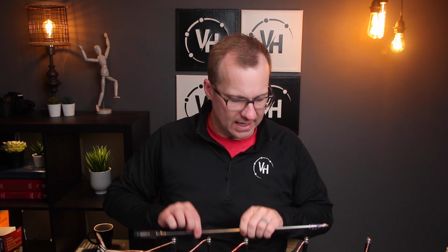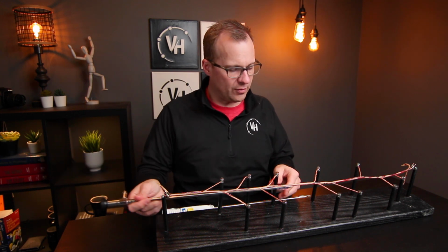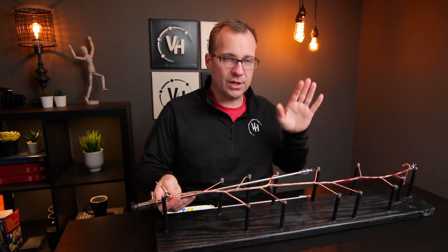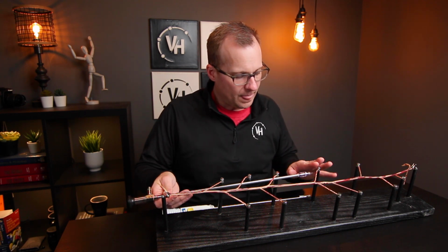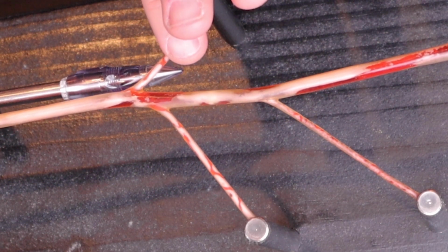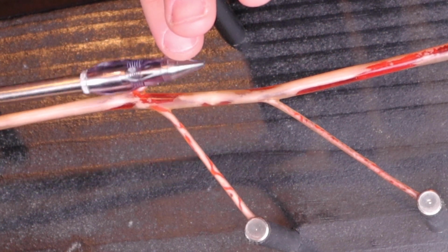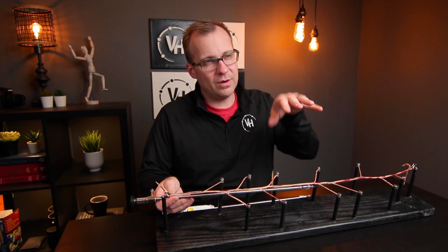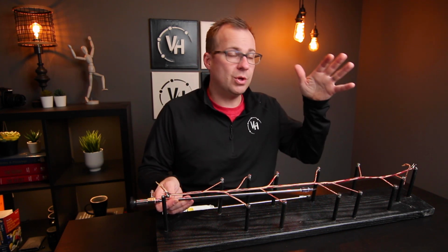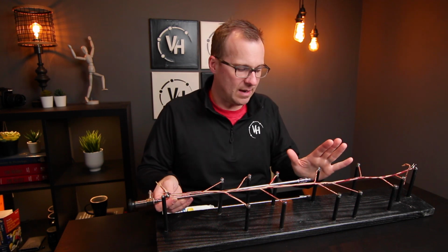Also, for underdeveloped branches, if you find that the reason is you can't quite get the angle, you can't quite get the scope for whatever reason up to the branch that you need to dissect out, don't forget to use your outside hand. You have another hand here that you can use; let's pretend I'm going to push down on my tunnel, which is going to push this branch into view so I can then pop my windows above and below. Maybe it's just superior, just out of reach. Sometimes up towards the groin, the vein takes a funny turn and it's hard to get that into view. So use your outside hand to push more of that branch into a position where you can see it, and then you can dissect that out.